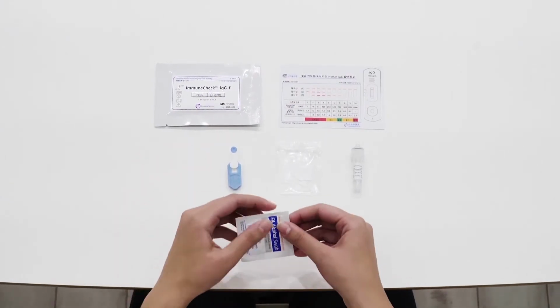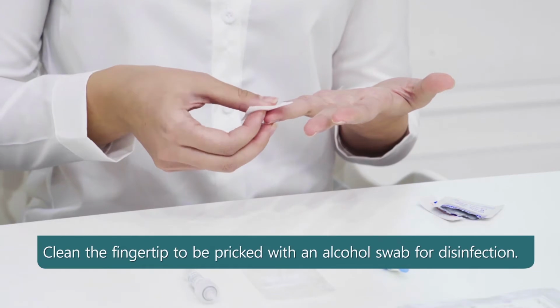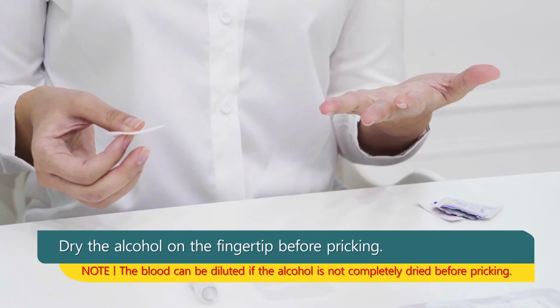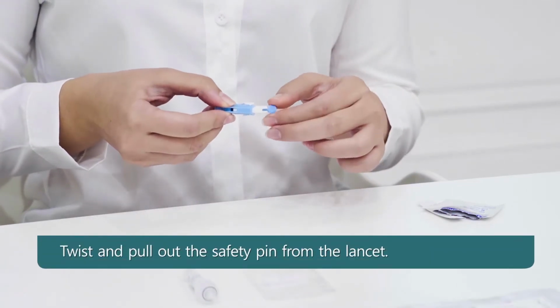First step, clean the fingertip to be pricked with an alcohol swab for disinfection. Second step, dry the alcohol on the fingertip before pricking. Third step, twist and pull out the safety pin from the lancet.